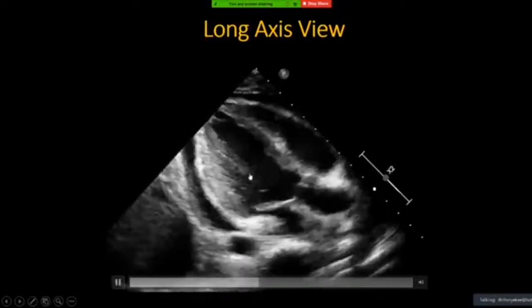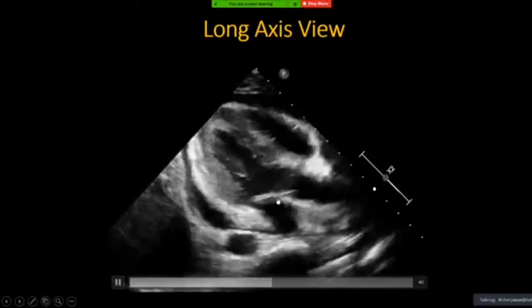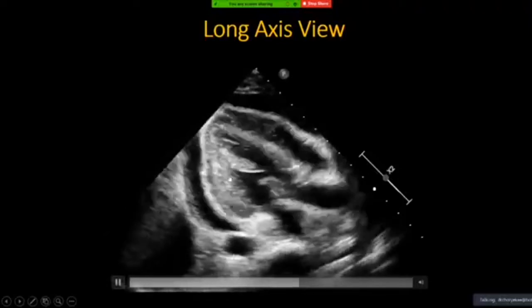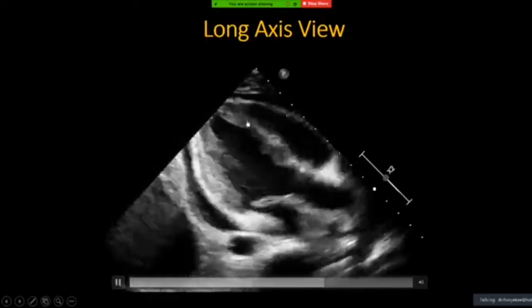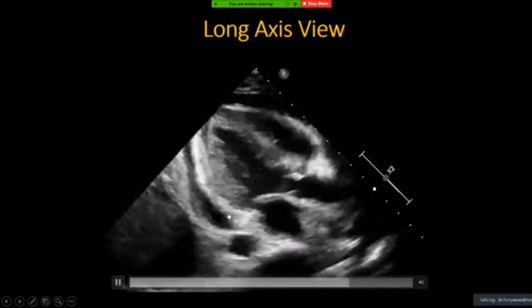After we look at the ventricular size and the aortic size, then you try to look at the valve. The valve structure seems to be okay, opening quite nicely. Then you look at the ventricular wall, whether they are contracting nicely. It seems to have very good contractility. Then look at any other structural anomaly. Look at the septum. The septal wall seems to be quite intact. And then you look outside. When you look outside, there's a significant pericardial effusion.